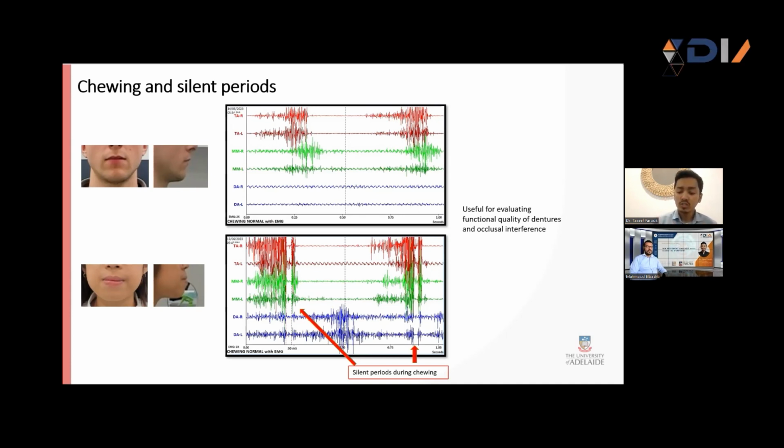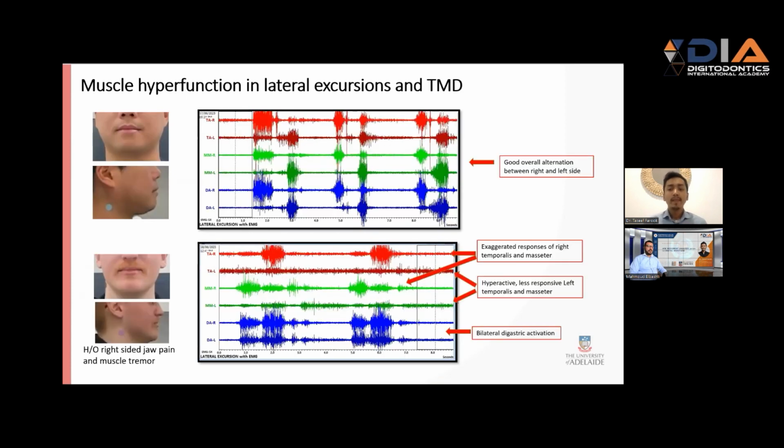which warrants treatment. And if you can show them that, even if you don't care about how you look, it is happening, and you are eventually tiring your muscles out because they need some time for your occlusion to reset, and then you can start chewing, and it helps the person be more aware of where they're at with their occlusion and their muscle functions that are affected by it.